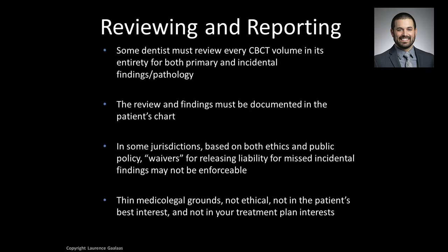So let's talk about your obligations on reviewing and reporting for cone beam CT. This will be specifically geared around Minnesota and the United States. I know I've got attendees here from all around the world, which is exciting. My disclaimer and advice here is to work with your own dental regulatory groups to figure out what is appropriate in your dental practice. But for us regionally here, if there's a cone beam CT, some dentist must review every volume in its entirety for both primary and incidental findings. That could be a general dentist, a specialist, or a specialty radiologist like myself. And of course that review and the relevant findings have to be documented in the patient's chart.